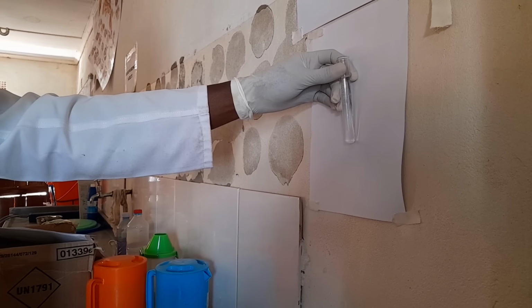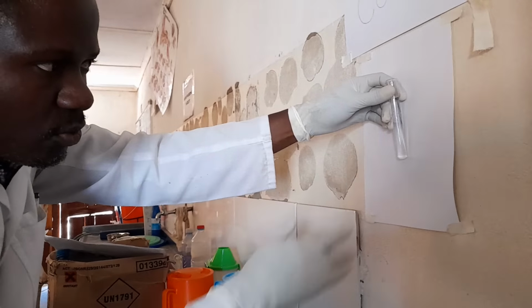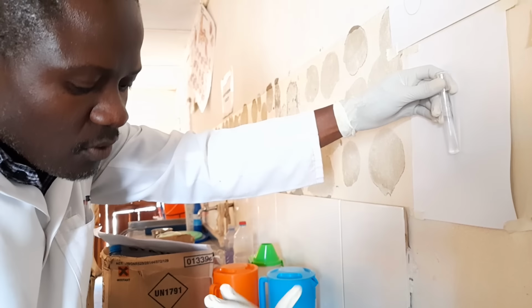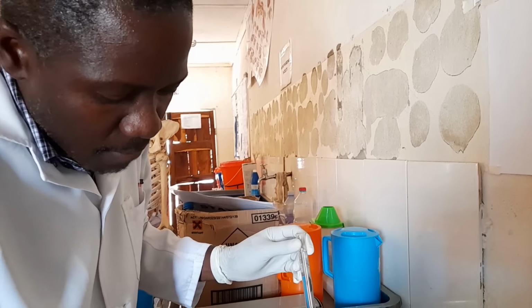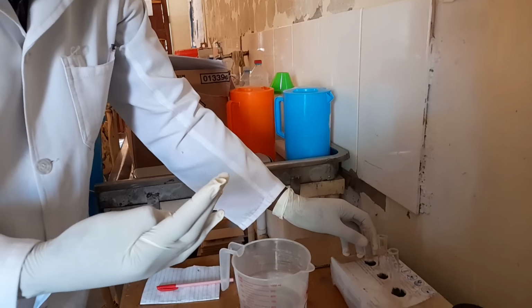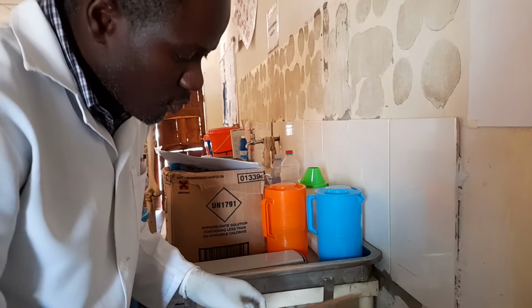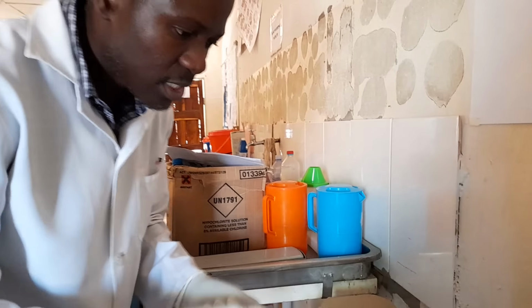You can even go in reverse. Number one, physical property, you will check for particles. In this case, no particles. Then we checked for color, which you said is straw amber. Then the amount and the smell. Those are the physical properties. From there, you can put this urine away. As you can see, my hands are not even in contact with urine.